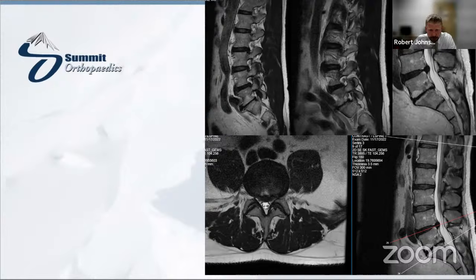And so we had that open discussion. We said, hey, are we addressing both? Do we do partial discectomy, do foraminotomies? Do we do this all from the front? Now, I've done this many, many times in my practice. If I see a disc, such as that upper right corner where it's contiguous with the disc space, more often than not, I can get it straight from the front. And then you have that indirect decompression aspect of it as well.